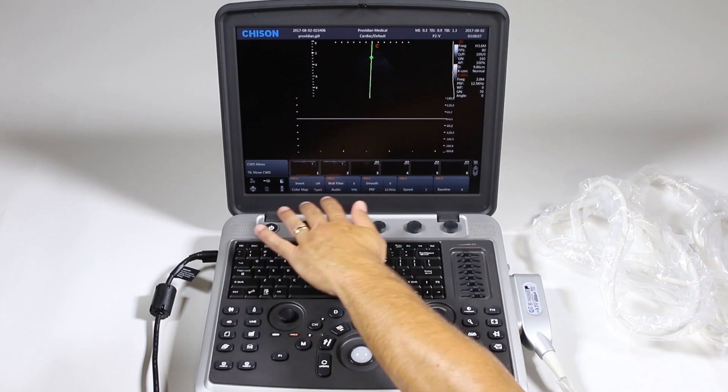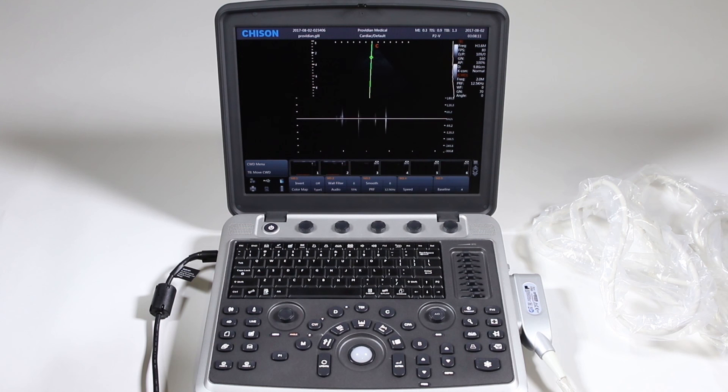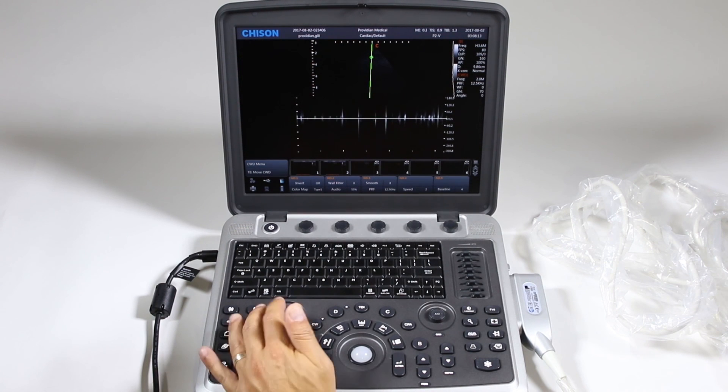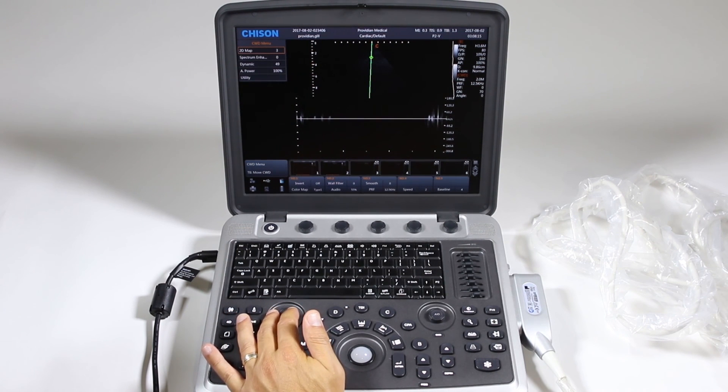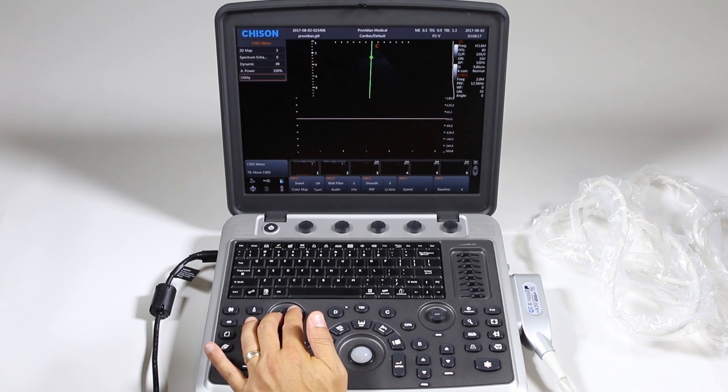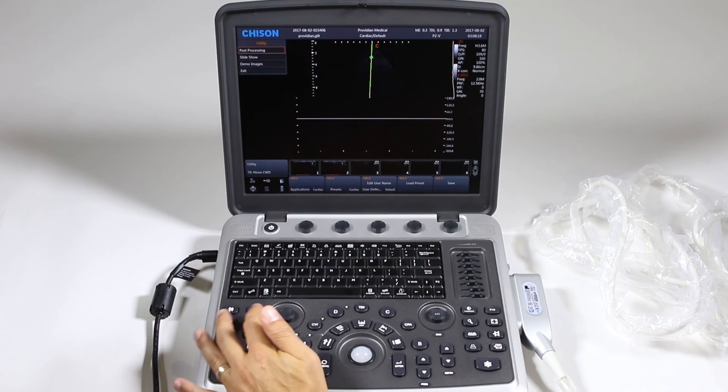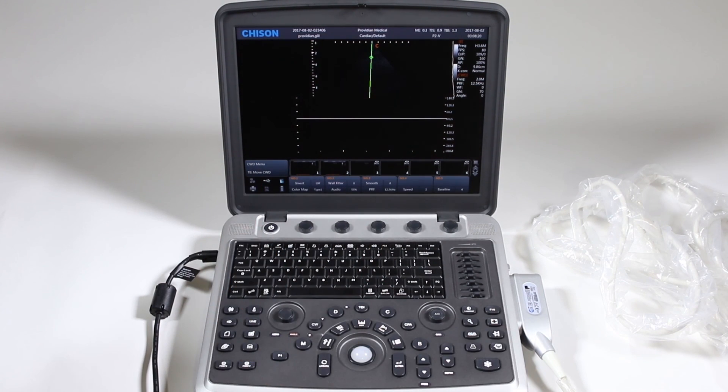Just like PW Doppler you can change your angle here. And same kind of items along the bottom as far as inverting, map, wall filter, etc. Clicking the menu doesn't give you a whole lot more than you would see in anything else. Utility and I can either exit but again I'll just use this button here.